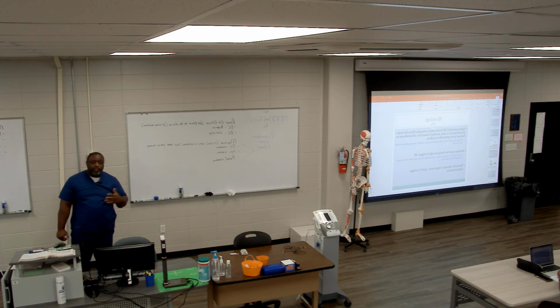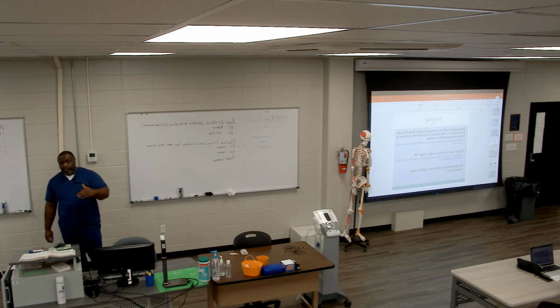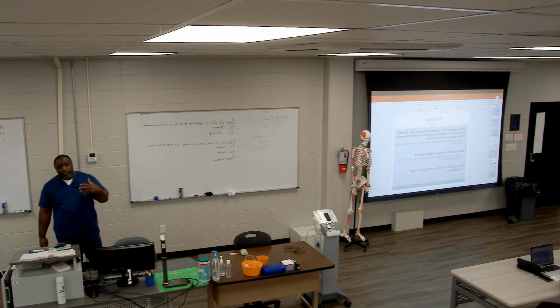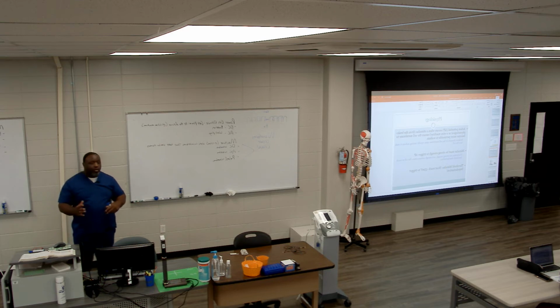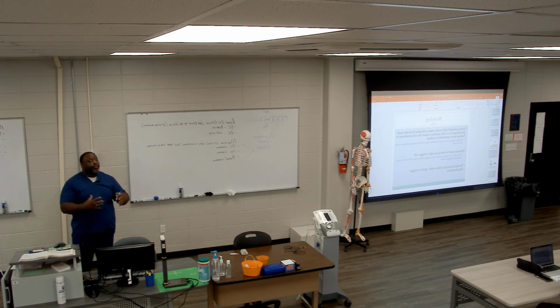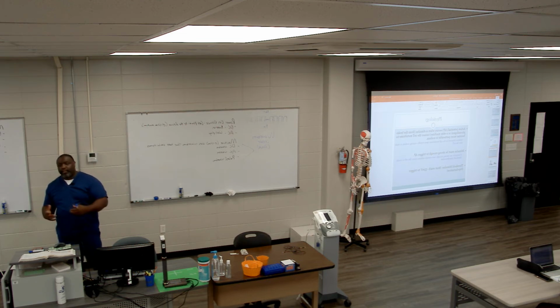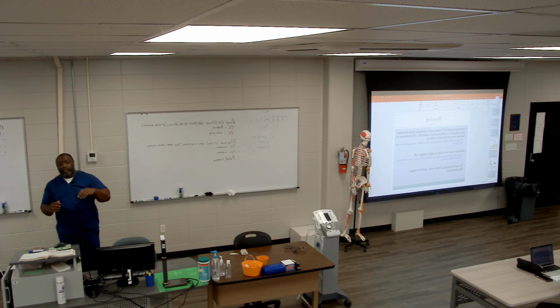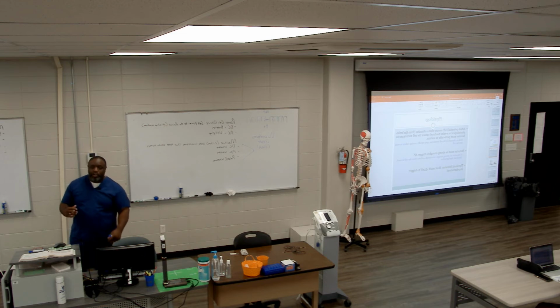So an action potential hits, it's an electrical stimulation, an electrical signal that either comes from the brain or an E-Stim machine, and then it triggers information to the peripheral nerve to tell the peripheral nerve, hey, we need to now start the process to fire the nerve to do whatever action we're trying to do.